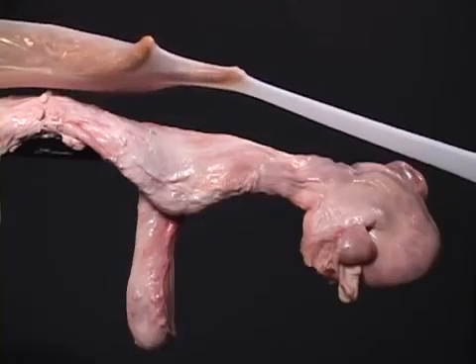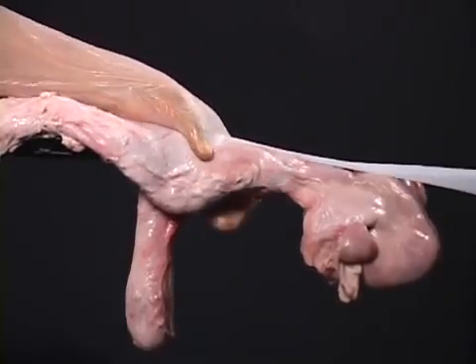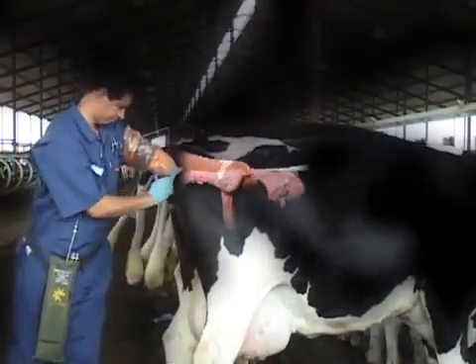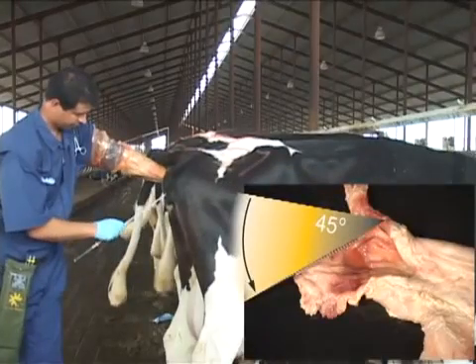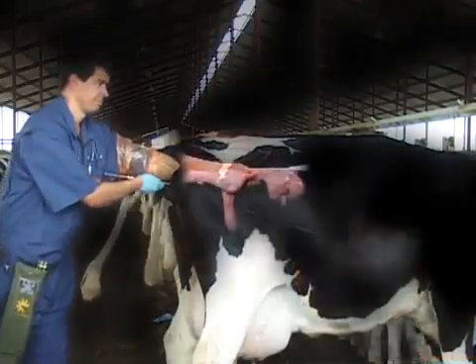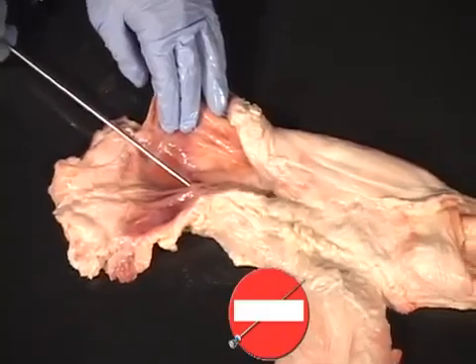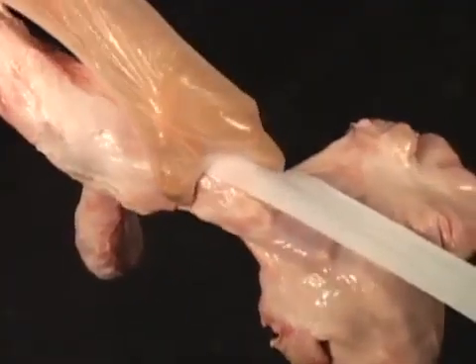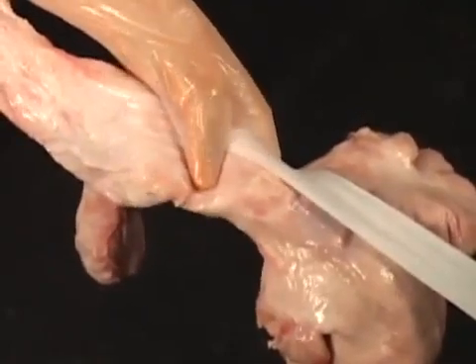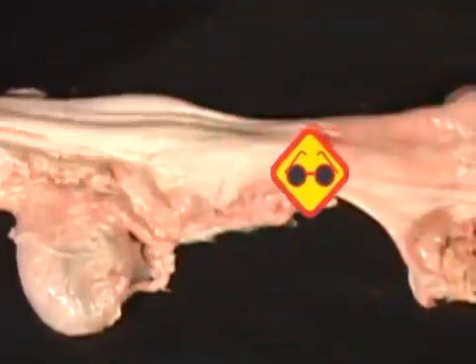Gently slide the hand from the upper part of the rectum to the lower part to identify the cervix. Hold the cervix with your thumb on top and the rest of your fingers on the bottom. Thoroughly wipe the vulva area clean with a paper towel — this helps to prevent the interior of the reproductive tract from becoming contaminated and possibly infected. Insert the insemination gun through the vulva at a 40 to 45 degree angle until it touches the roof of the vagina, then level the gun to go through the passageway to the cervix. This procedure avoids the possibility of entering the urethra located on the floor of the vagina. While passing the instrument through the vagina, push the cervix forward to stretch the vaginal wall, eliminating the possibility of the gun getting caught in a vaginal fold.